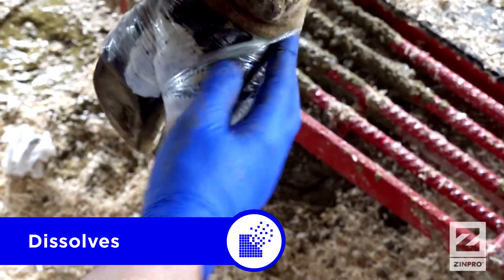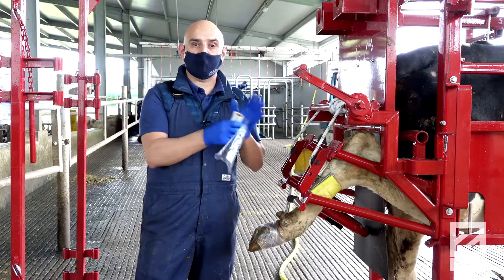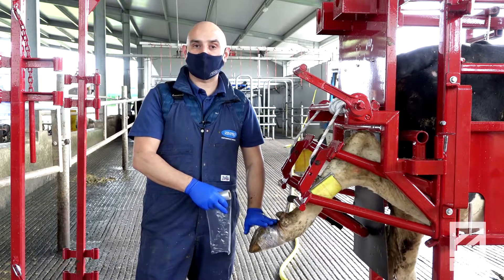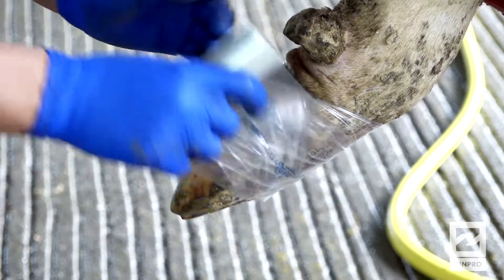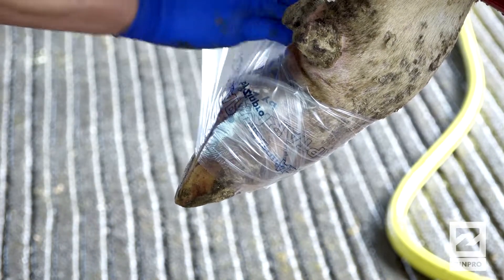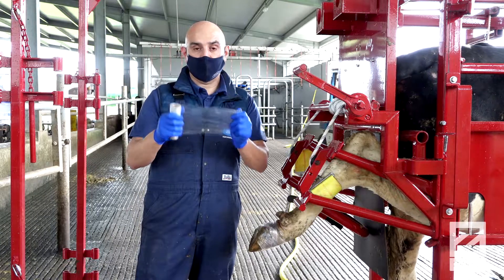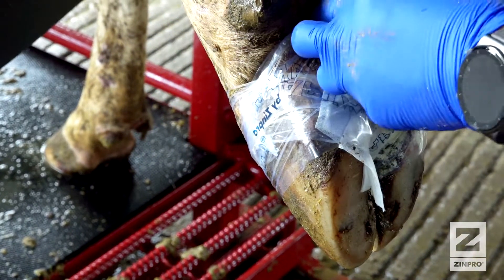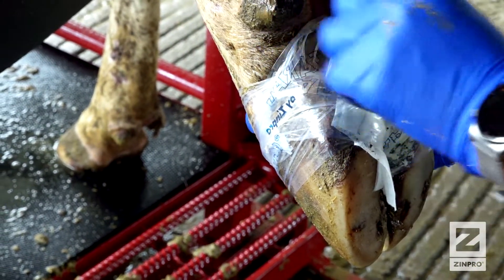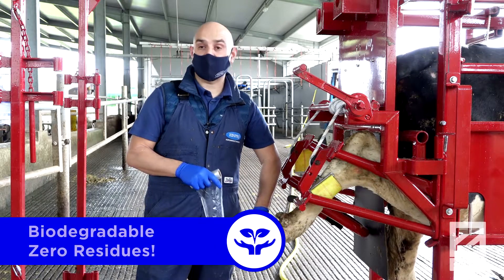A tip: do not complete more than 360-degree turns, because the bandage can stay around the leg like a ring while in the heel where you have applied the treatment it could dissolve much faster, giving an erroneous impression that the bandage is still on. Practically it doesn't make a whole lot of difference, but it's a visual disturbance.